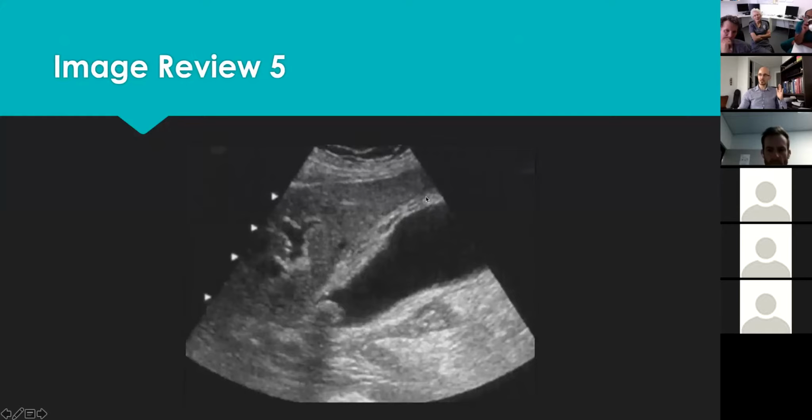But even this area is completely perpendicular to the line because it's a curved probe, so the line is coming like that. So even in that area that is completely perpendicular to the line of the ultrasound beam, it's still thickened. And the other thing is, do you see that striation, that heterogeneous looking hypoechoic, hyperechoic pattern? That's actually edema inside the gallbladder wall.